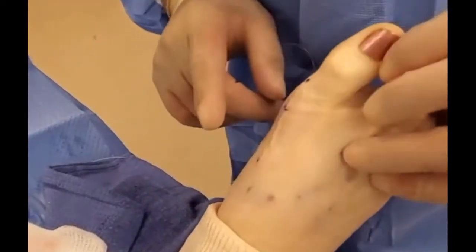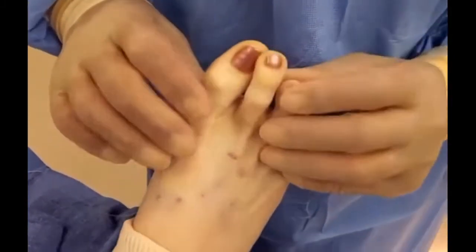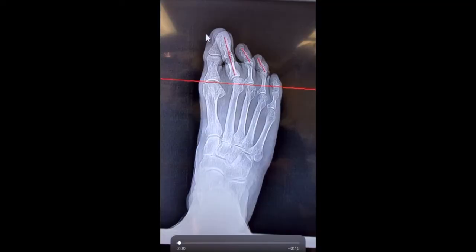We just finished the bunion correction on this patient. As you can see, the incision is just sewn up. Now we have to fix this second toe and these toes from climbing over.